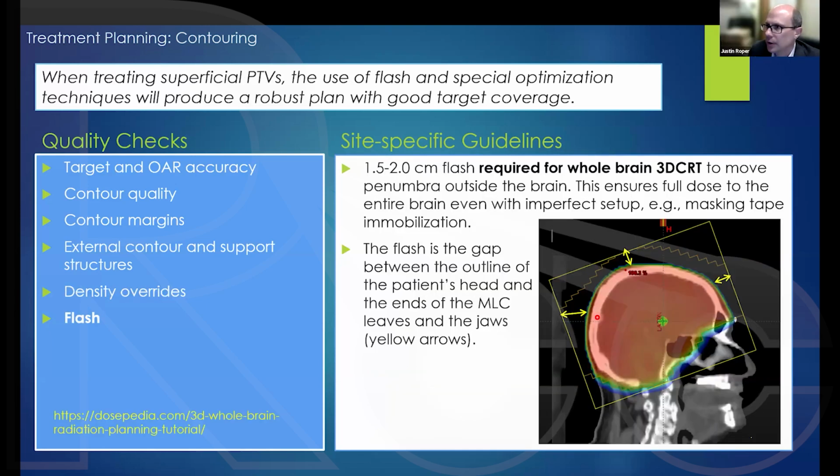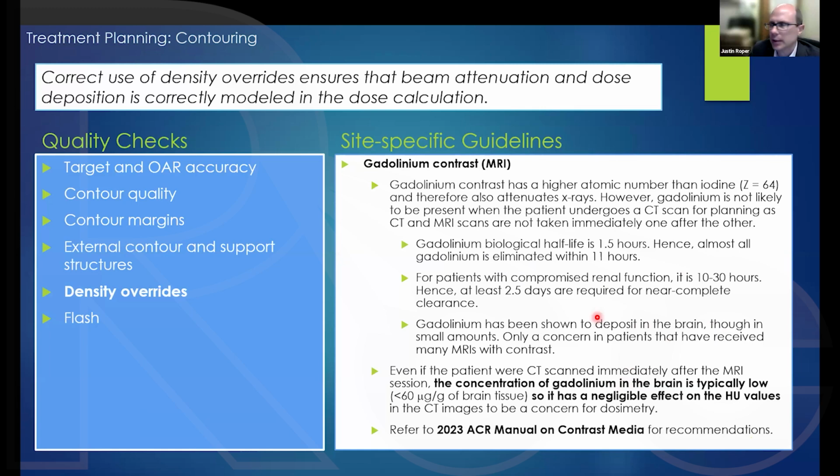Jose, we have a question from the chat. All right, and that question is this. Using the BrainLab device during CT imaging, the mask is formed while the device is on the table. However, during treatment, the device is out of the couch. What are your thoughts on the accuracy and reproducibility in this case?